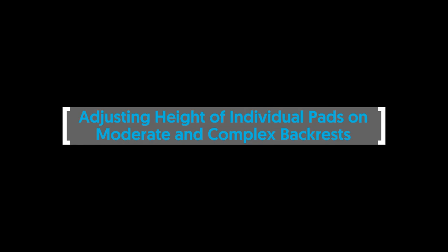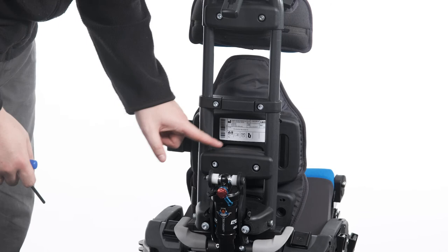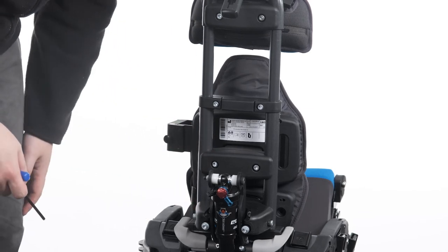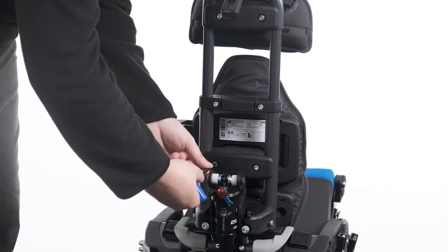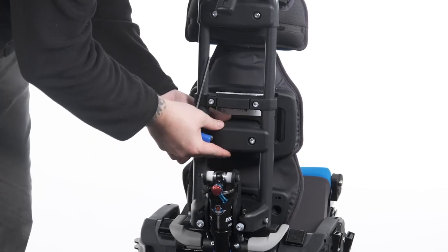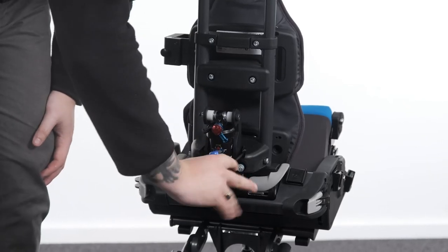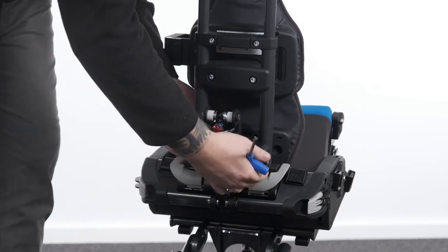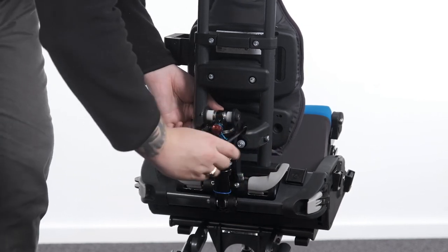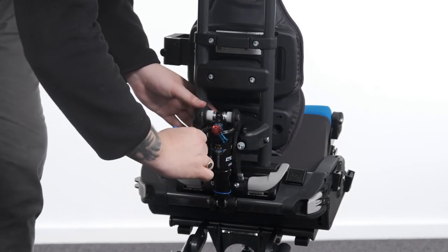Adjusting height of individual pads on moderate and complex backrests. The moderate and complex backrest pads have two clamp options: the basic or complex clamp. To adjust the height of the basic clamp, loosen the bolts and slide the clamp up or down the backrest tubes to the desired position. Tighten the bolts to secure in position. To adjust the height of the complex clamp, loosen the bolts and slide the clamp up or down the backrest tubes to the desired position. Tighten the bolts to secure in position.